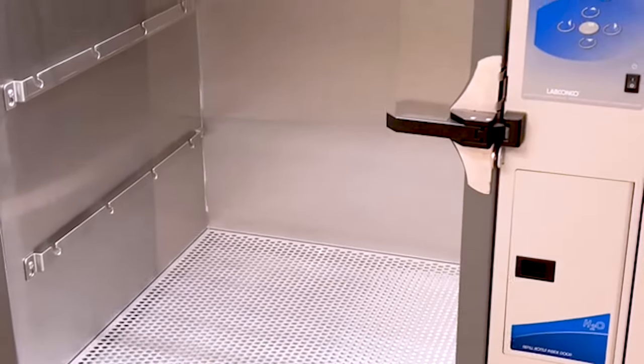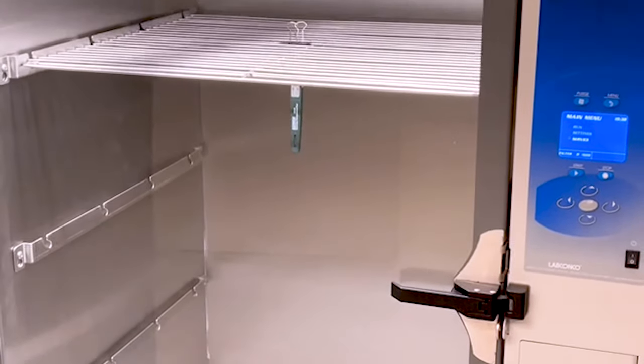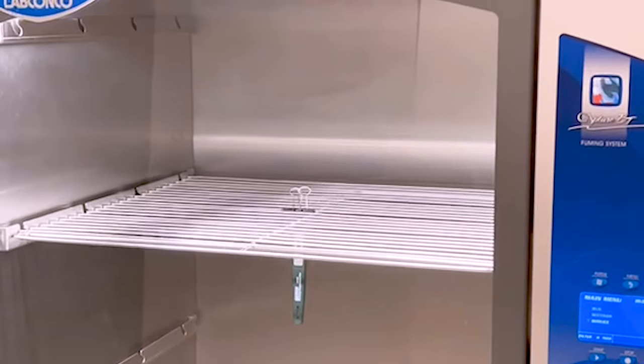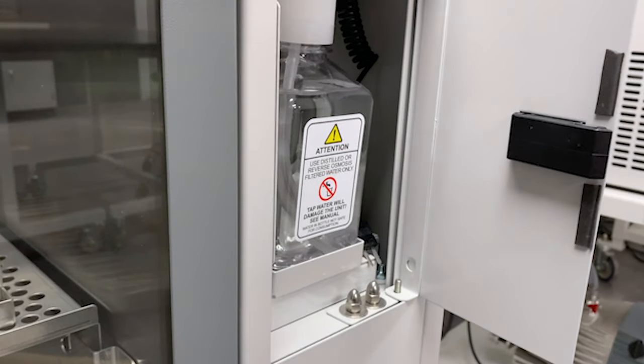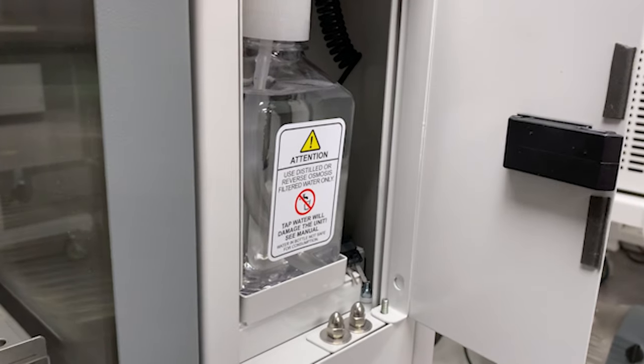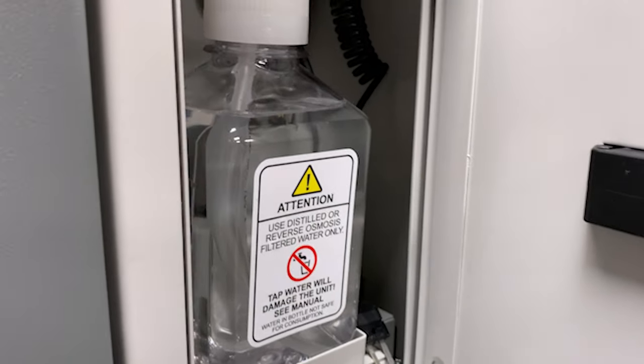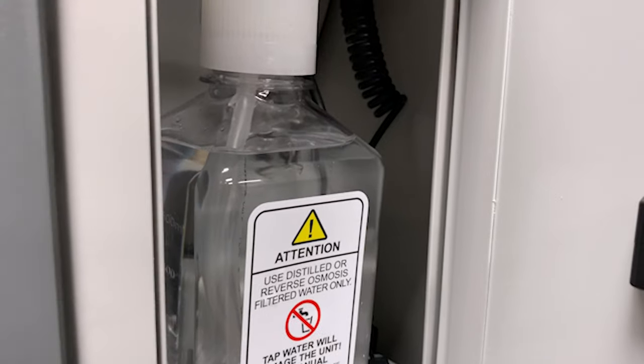Place the hygrometer on a shelf, as close to the center of the cabinet as possible. We've used a paper binder clip to hold the hygrometer to the shelf. Also, make sure the water bottle is full of water — it'll be in the compartment below the button pad. We recommend using purified or distilled water.